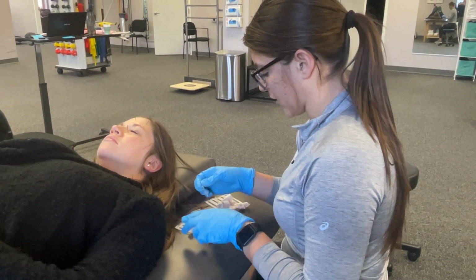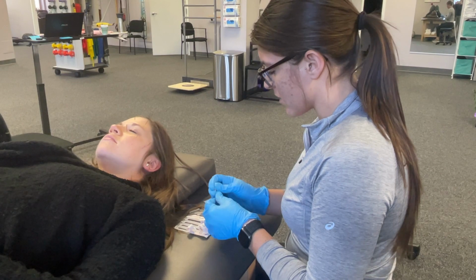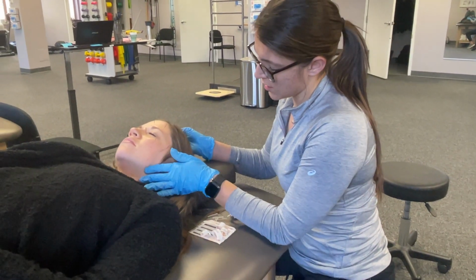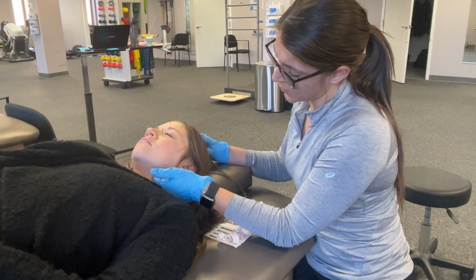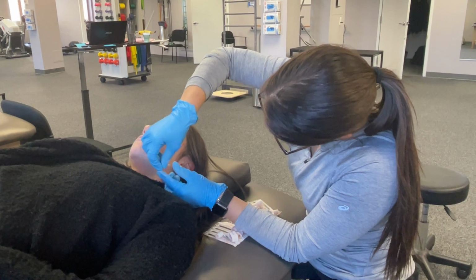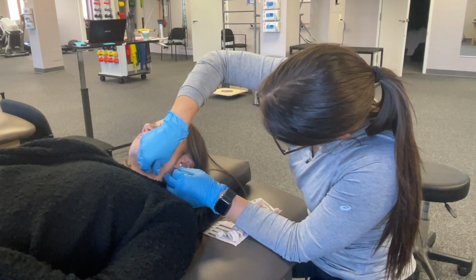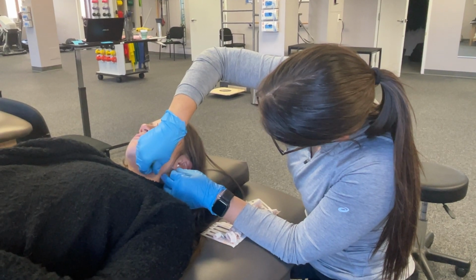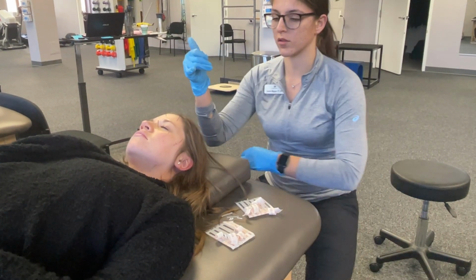Okay, one more place I'm going to show you to put a needle in this situation is going to be into her medial pterygoid muscle. And that is accessed by coming down along the mandible to the inferior angle, and we're going to come straight up under her jaw. So depending on the person, you might need a little bit longer than a 15 millimeter needle for this one. All right, good. Let's get a close-up of her face.